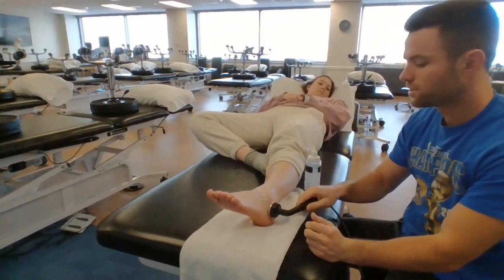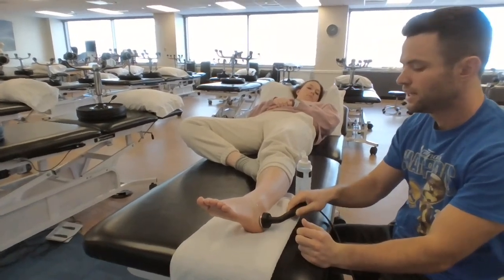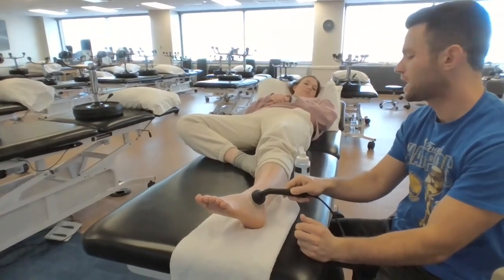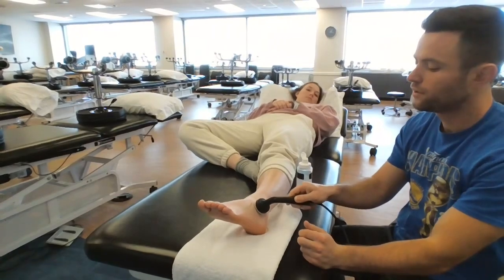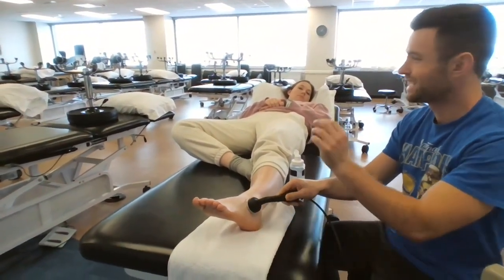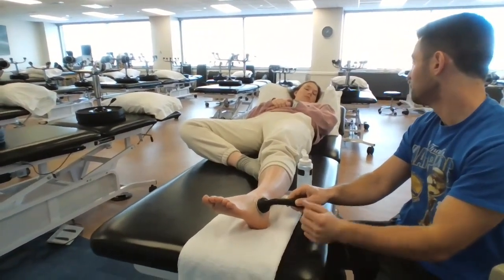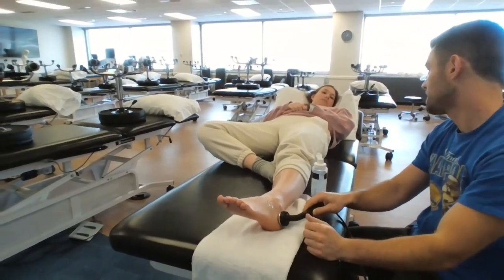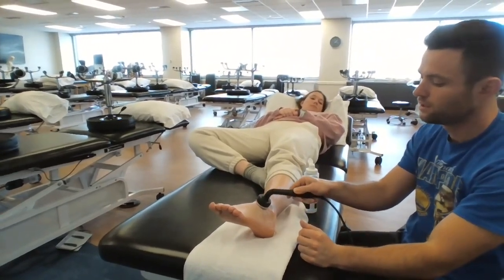Again, what we're doing is we're sending sound waves down into that ankle. You shouldn't feel much with the settings that I have on. Something that you could feel is it might start to get a little warm, maybe like a burning sensation. If that happens, tell me, because that means I need to change something on my end in the machine so that you don't feel that, because you don't want that, okay? So you've got to pay attention to what you're feeling.